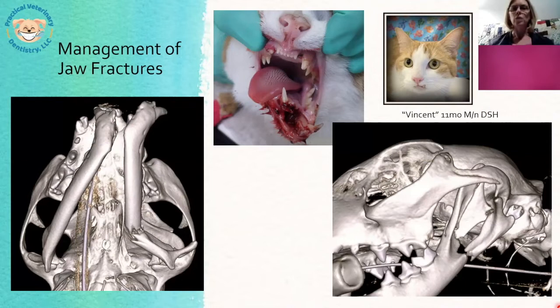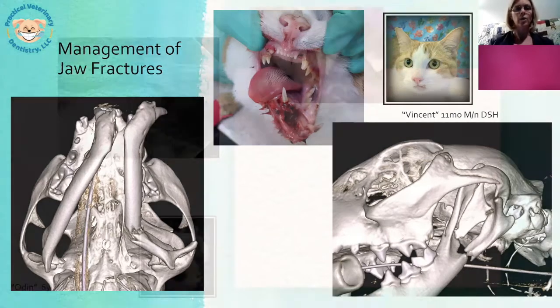We can manage that with the treatments that we need to do and be able to get that type of imaging. So this is the kind of thing that, yes, a traditional CT would work great, and you probably would be doing a CT for any type of fractures, but lots of patients that we wouldn't normally be doing CTs on, I'm finding that we are getting really valuable information out of it.